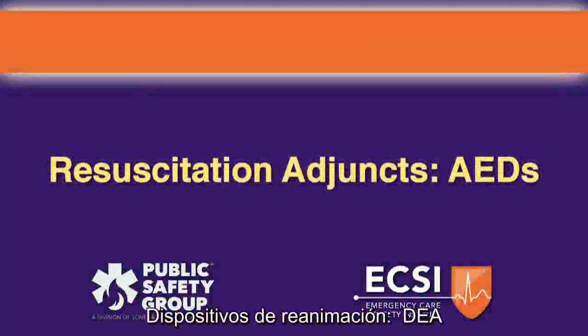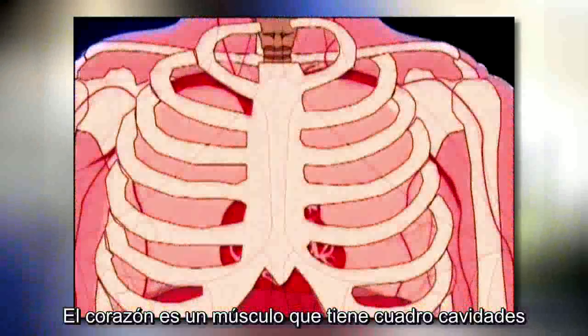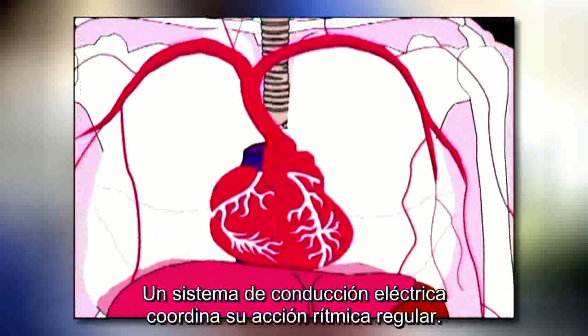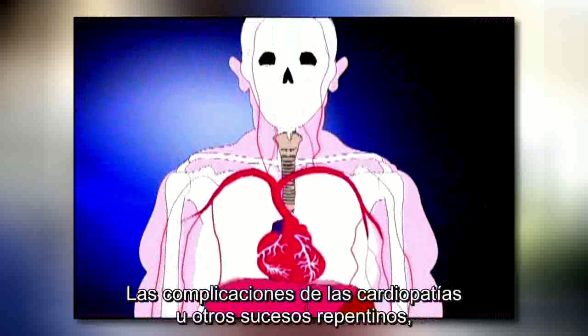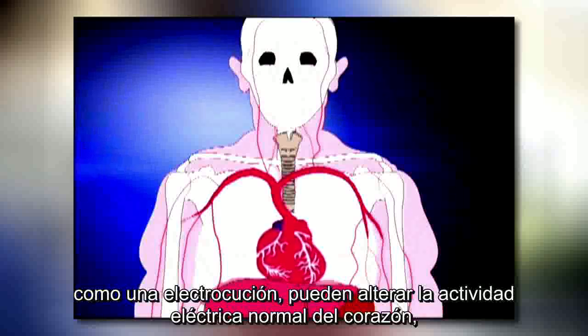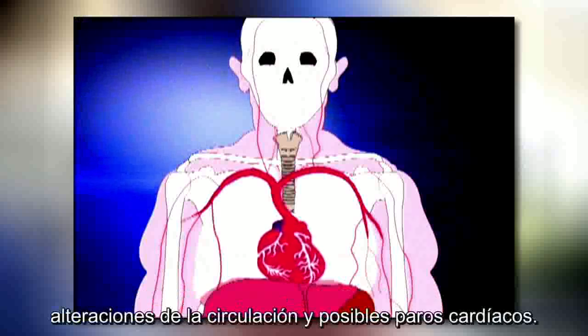Resuscitation adjuncts, AEDs. The heart is a muscle with 4 hollow chambers that pump blood throughout the body. An electrical conduction system coordinates its regular rhythmic action. Complications from heart disease or other sudden events like electrocution may disrupt the heart's normal electrical activity. The result is abnormal heart rhythms, disrupted circulation, and potential cardiac arrest.